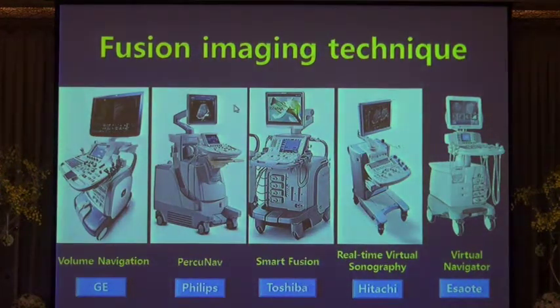As you may know, there are various fusion imaging techniques developed by different companies. Volume Navigation by GE, PercuNav by Philips, Smart Fusion by Toshiba, Real-time Virtual Sonography by Hitachi, and Virtual Navigator by Esaote. Among them, in this presentation, I will show you the Volume Navigation technique based on my experience with this system with more than 700 cases of RFA.